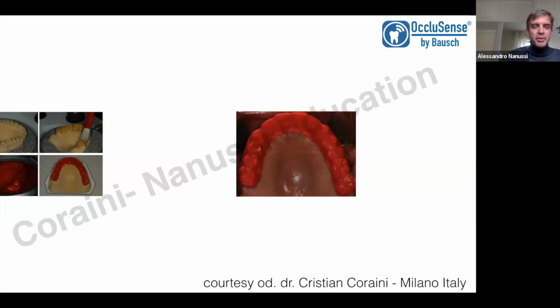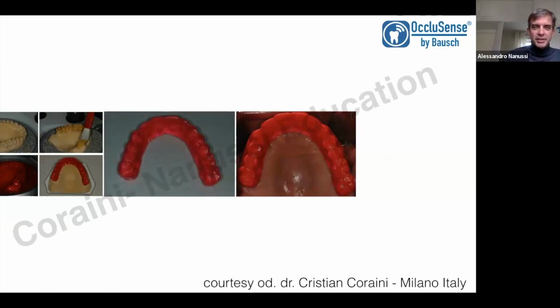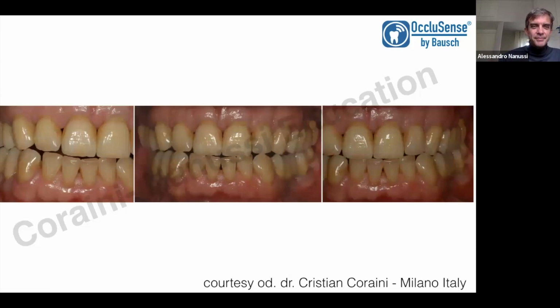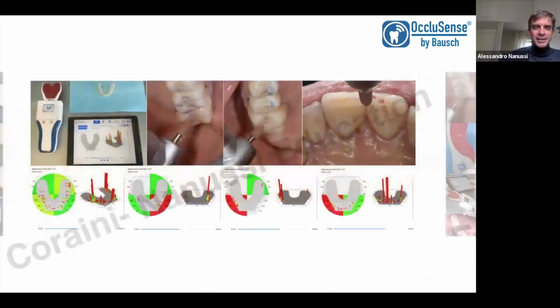We repeat the Brux Checker. You can see how to produce a Brux Checker. It's simple and not expensive. And we check the checker with the patient. And the contacts are, after 9 years, totally different. The patient has a stable jaw assessment. He's comfortable, he has no problem, but they are not the same contacts. We have to balance it.